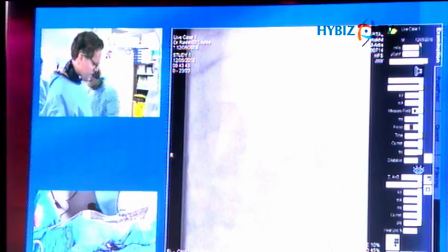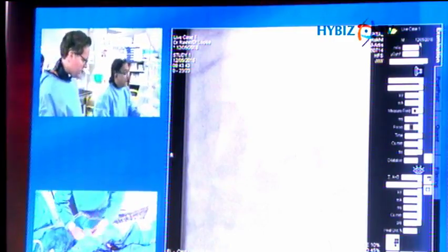So now we're going to take the device. We're going to go for the size 3.5 by 45. The smaller number is the distal diameter. It's on a stepped balloon as well, so the proximal part of the stent is actually bigger. This is very nice for these kind of tapering ectatic vessels, where there's obviously always a risk of edge dissection distally in any such device. This is the device, yeah.